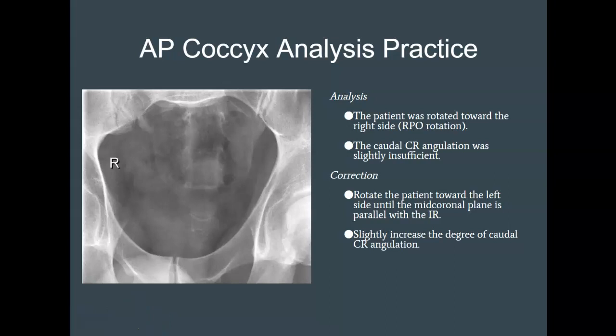Please watch part 2 of this image analysis for the lateral sacrum and coccyx.